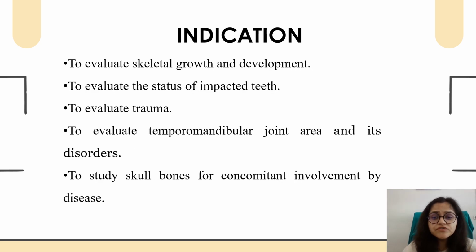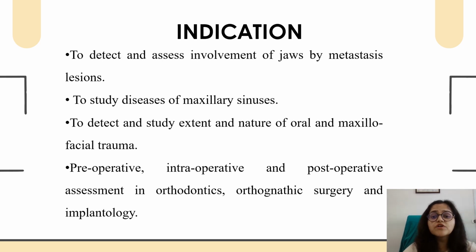To evaluate any skeletal growth and development, for any orthognathic surgeries, to evaluate the status of impacted teeth, to look for infection, to evaluate any trauma, to evaluate any temporomandibular joint disorders, to study skull bones for their involvement in diseases, to detect and assess involvement of the jaw by metastatic lesions, to study any disorder involving the maxillary sinuses, to detect and study the extent and nature of oral and maxillofacial trauma, and for preoperative, intraoperative, and postoperative assessment in orthodontics or any kind of surgery the patient has undergone.